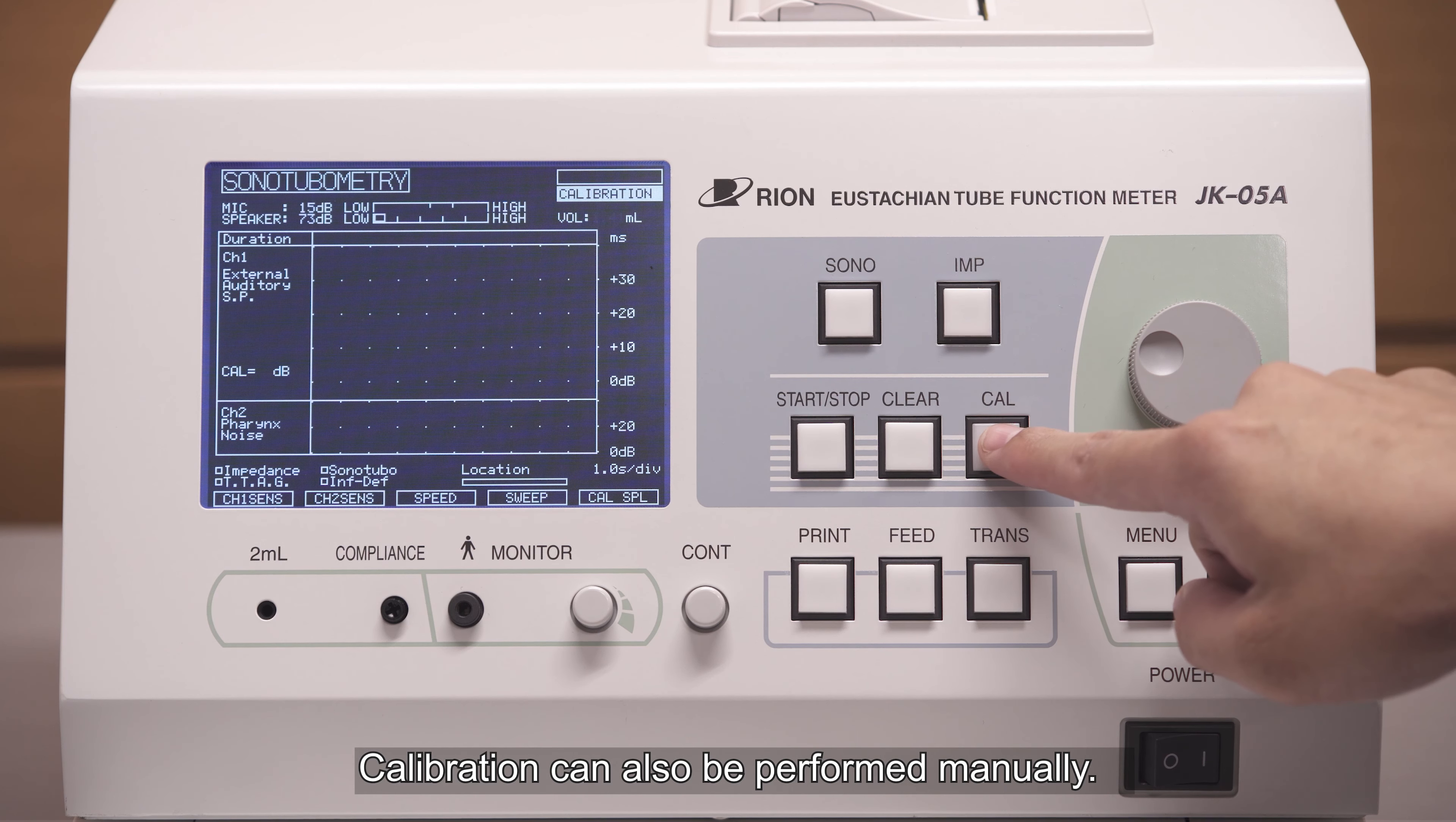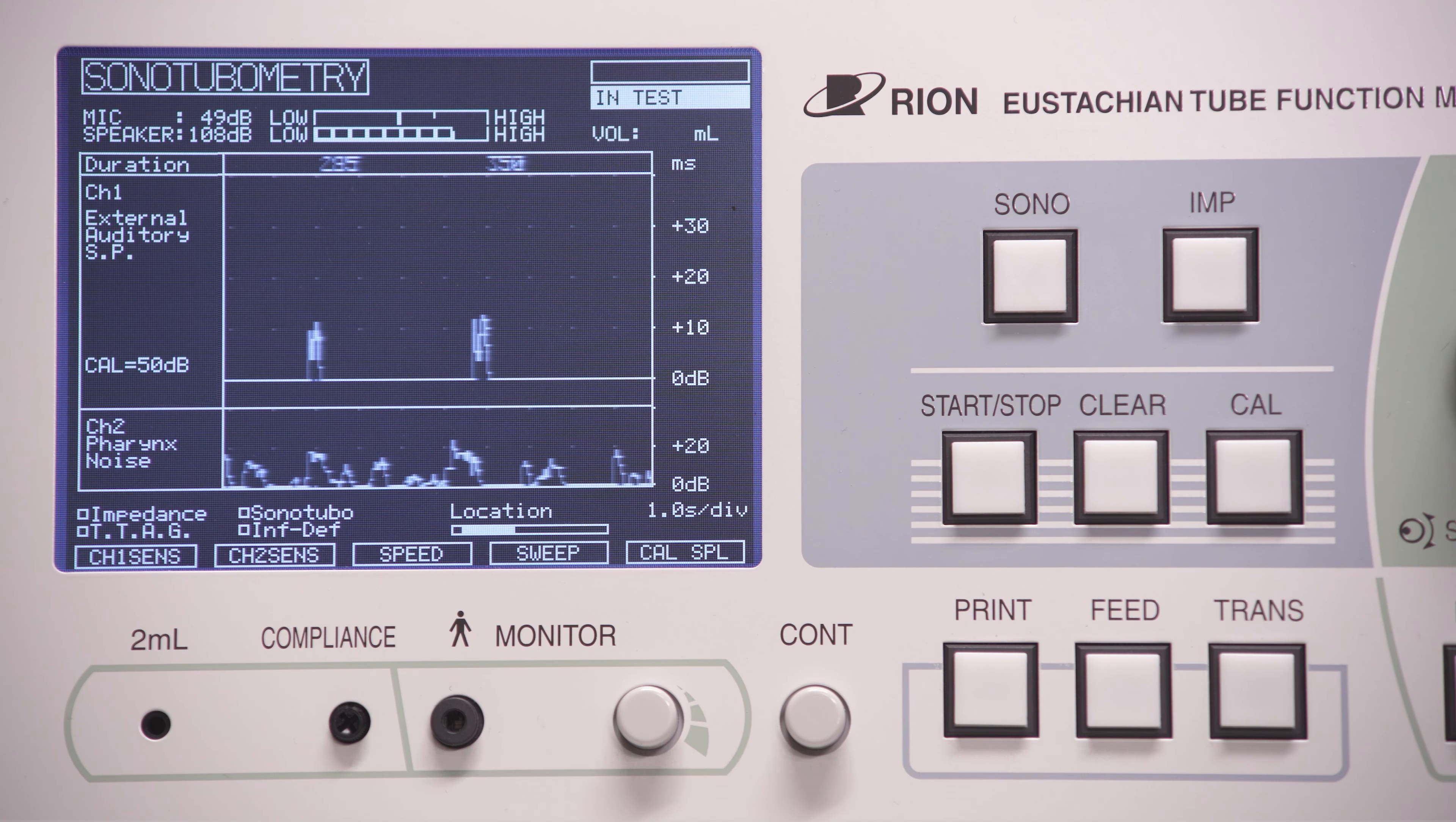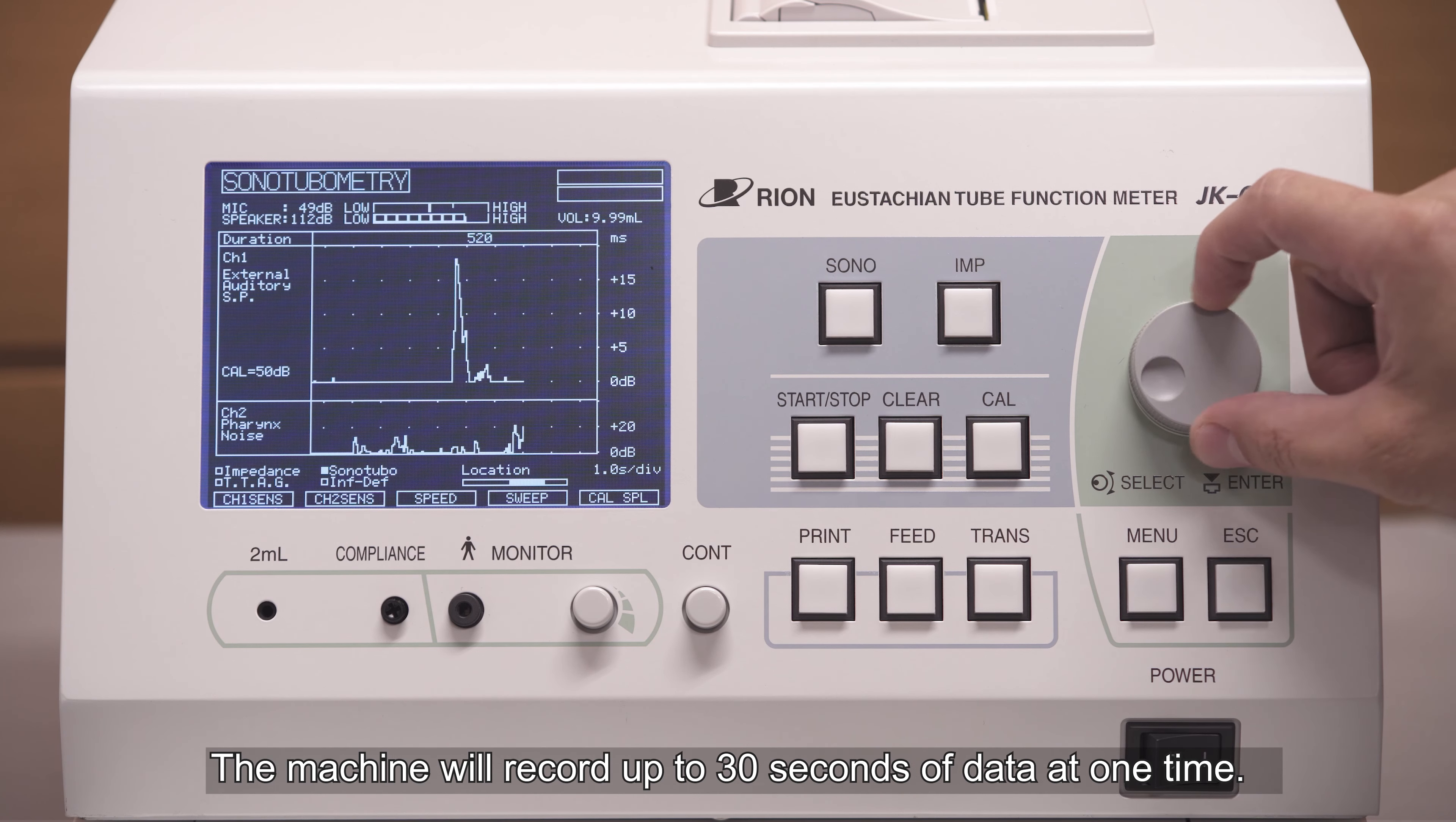Calibration can also be performed manually. The test screen will begin to scroll to the left. Instruct the patient to swallow. Press the start stop button to finish the test once the data you need has been recorded. The machine will record up to 30 seconds of data at one time.